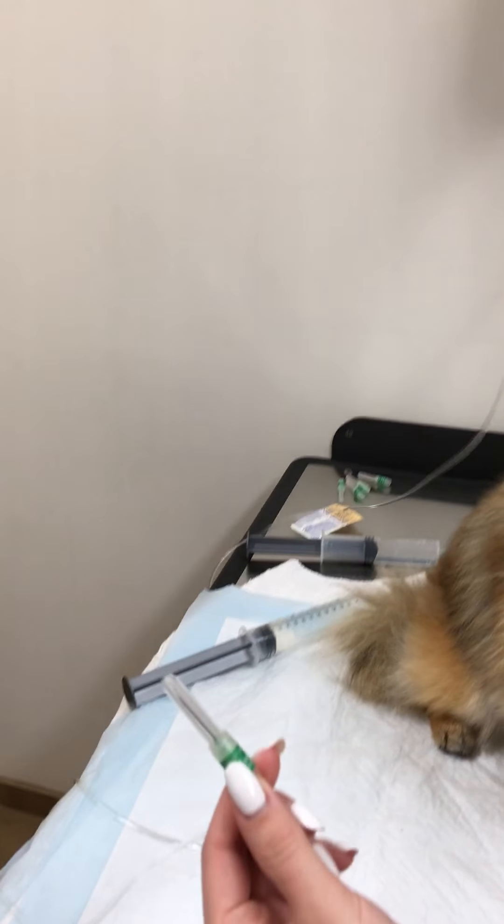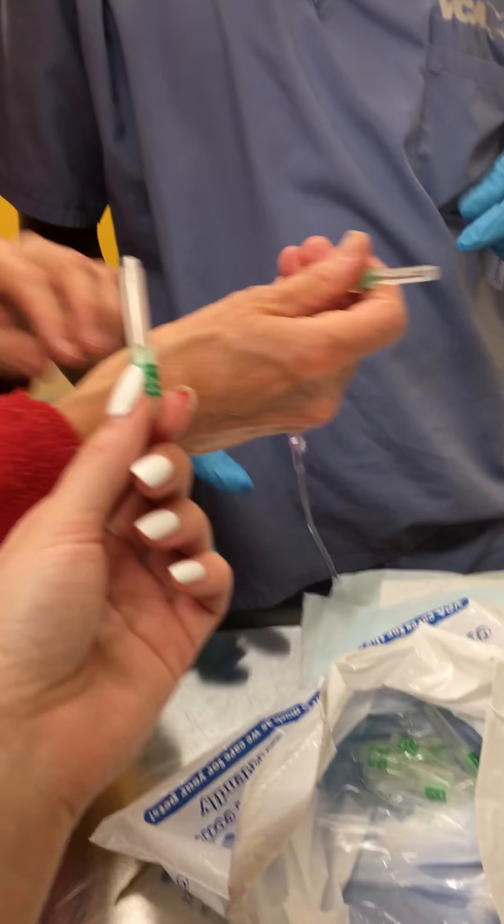It might be your arm is going to start hurting doing that. It's okay. I'll tell you because you're not done here. I don't want to get higher. So I need you to do it though. So you're going to have me do it. Okay, I'm going to try to do that. I don't know what I'm doing.